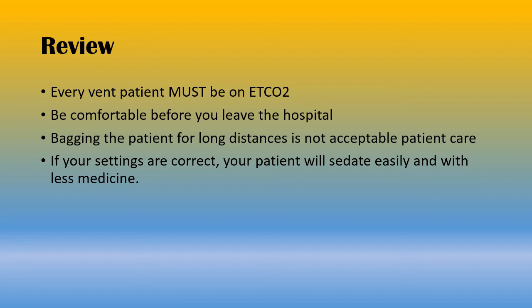Don't do it. If your settings are correct and your patient has a physiologic normal tidal volume, normal respiratory rate, normal minute volume, they're going to require less sedation and they will be way more comfortable for your transport. So make sure your settings are correct. Once your settings are correct, they're going to require very minimal sedation. You shouldn't have to paralyze them, and your transport's going to go just fine.